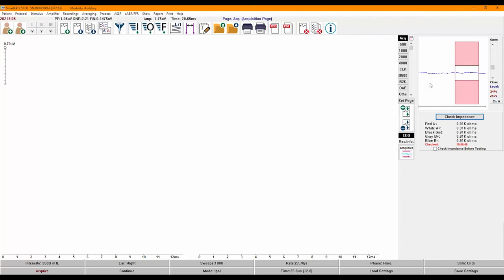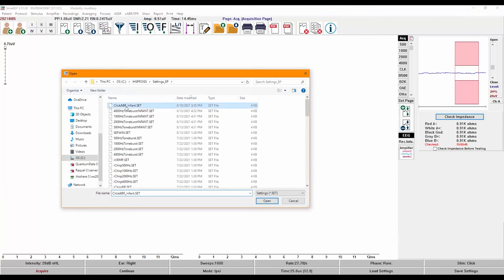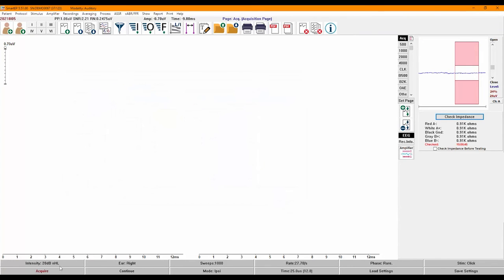The blue line represents the incoming EEG and the red shaded area is the artifact rejection region. When the blue line goes into the red area, the sweeps will be rejected; when it stays in the white area, the sweeps will be accepted. I'll click on Load Settings, select my Click ABR settings file, set my intensity to 80 dB by double-clicking, and click on Acquire.